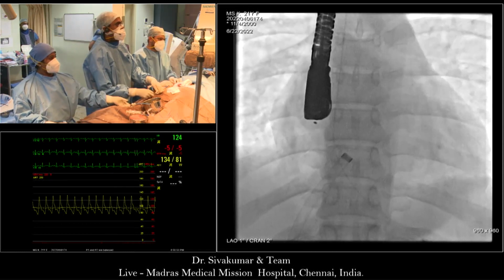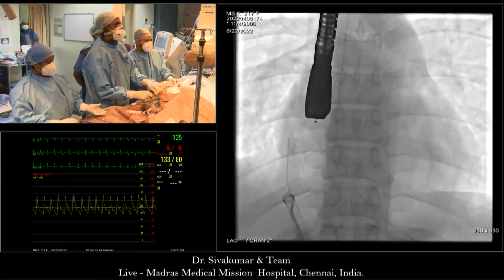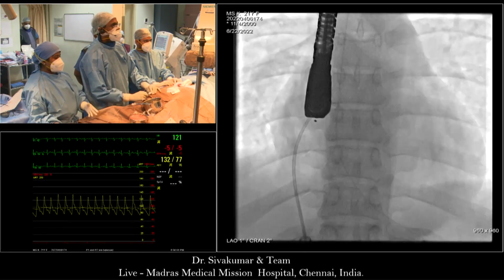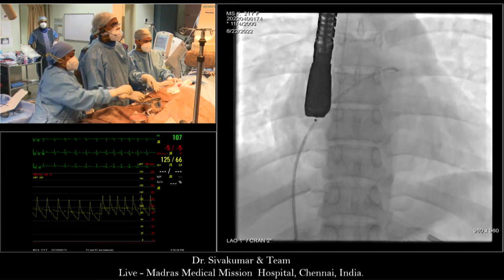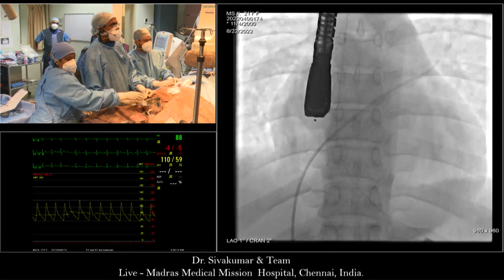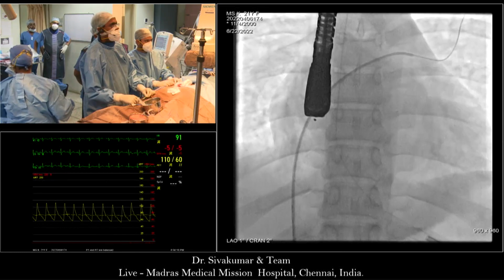Otherwise, a 40 device made with the same wire as a 4 will be like spaghetti. In the Amplatzer, the wire thickness increases at certain sizes, while other devices change the wire thickness at different diameters. So yes, it can make a difference. Theoretically, you could be right.